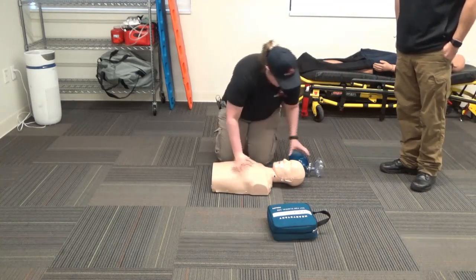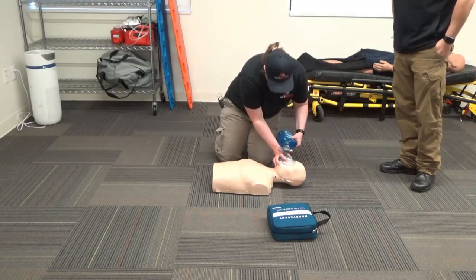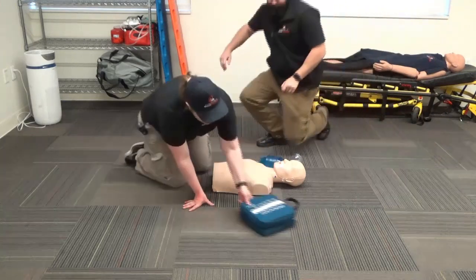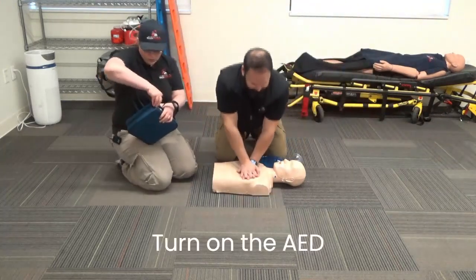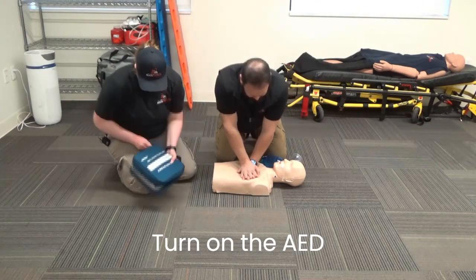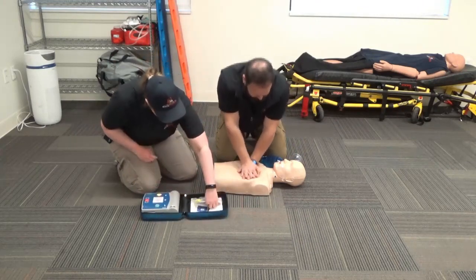30. I've got compressions. I'm going to start the AED. First step — turn the AED on.